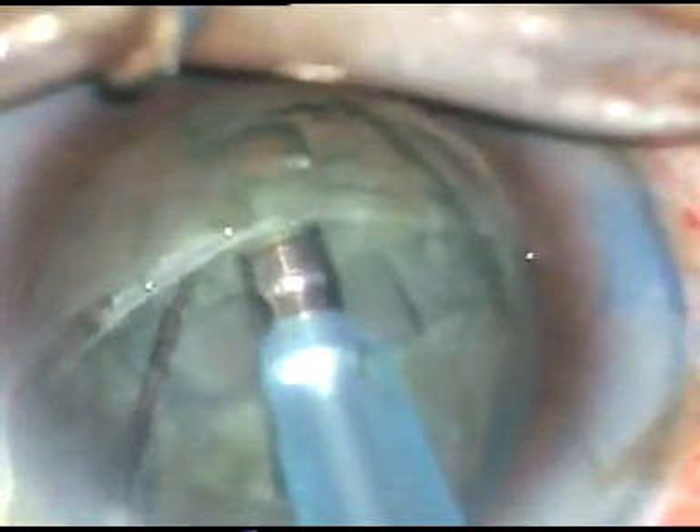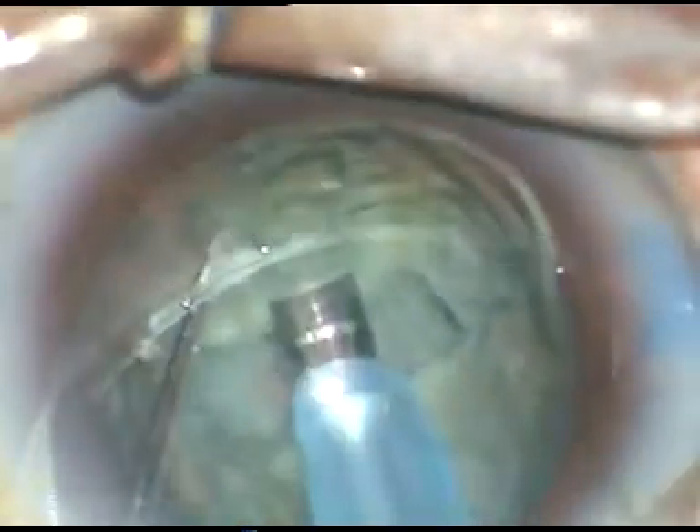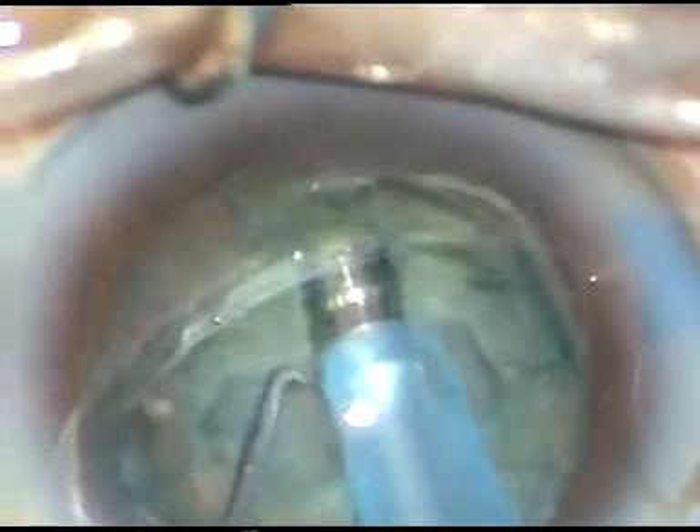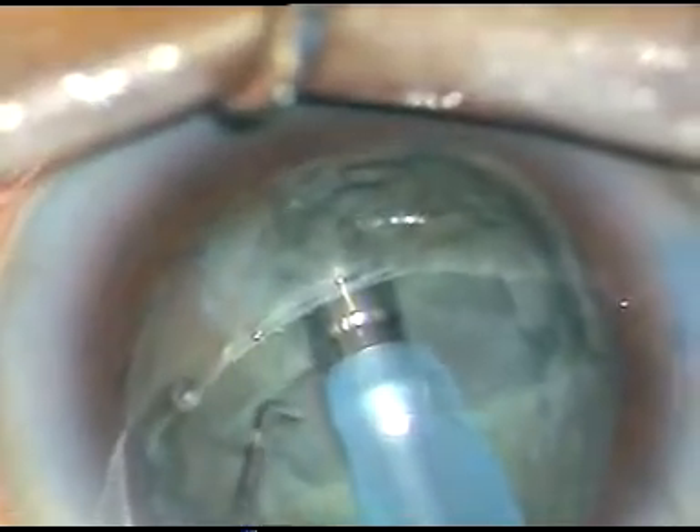In the divide and conquer technique, it is very important that the nucleus rotates nicely. A trench is then made on the other hemi-nucleus, so it has become a plus sign. We have to go to the proper depth so that we can divide the nucleus in one go without struggling. This proper depth is very important.